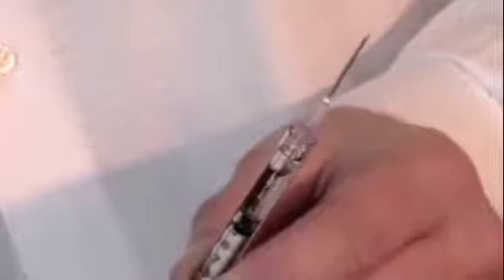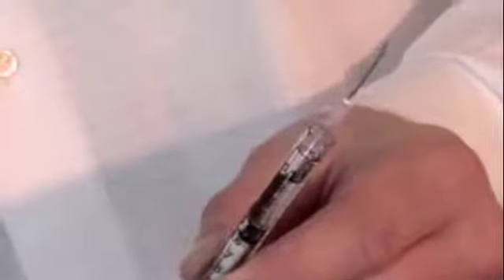So we've now aspirated the appropriate dosage into the syringe. There's always going to be a little medicine left in the needle. We're going to withdraw that into the syringe so that it's not wasted. We can recap the needle. Be very careful during this step.